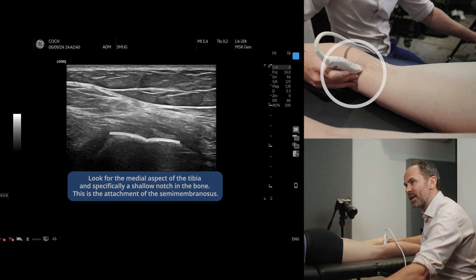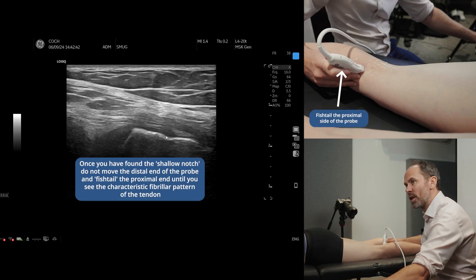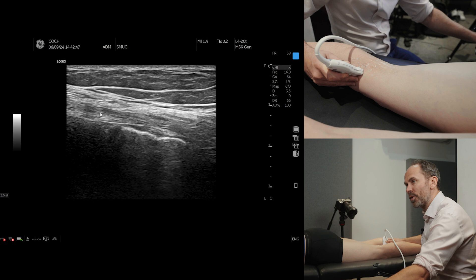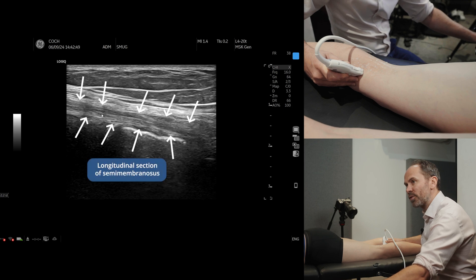Now all you need to do is keep this side of the probe still and fishtail the other side of the probe, and then you can see that lovely semimembranosus running up the back of the knee joint.